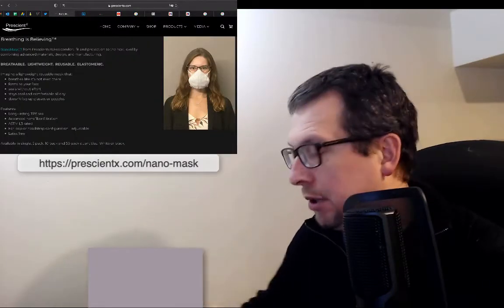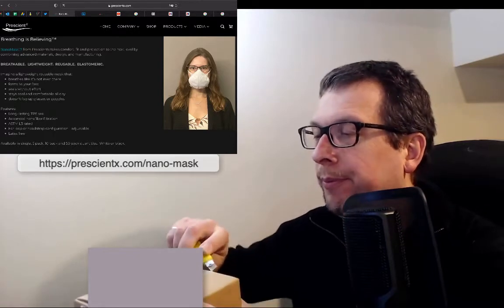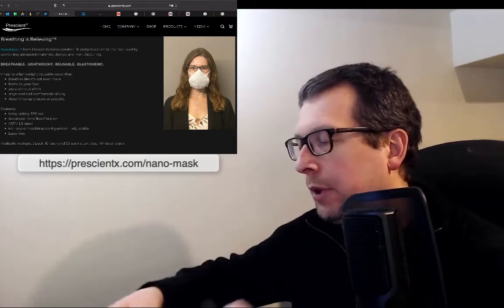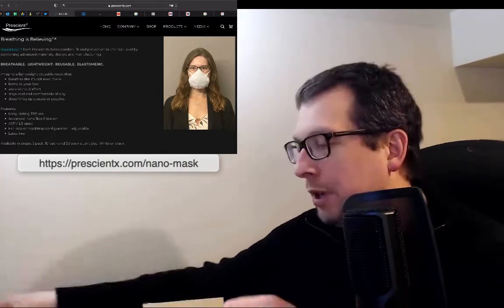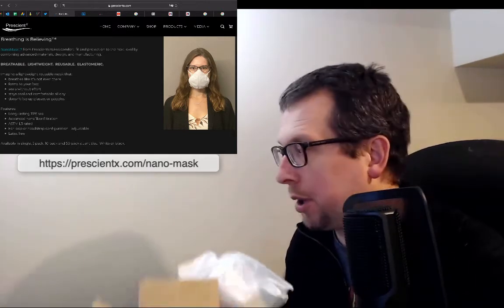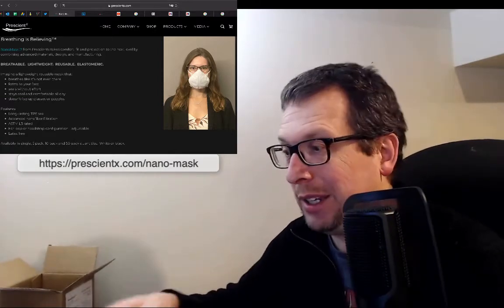I received a nanomask from Prescient X and I'll take a look at it — open up the box. So I bought this a little while ago and haven't had a chance to do anything with it yet. But now that I'm going back to in-person work at York, I figured it would be nice to have something that's comfortable to wear inside my office.